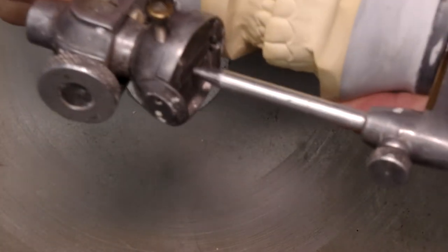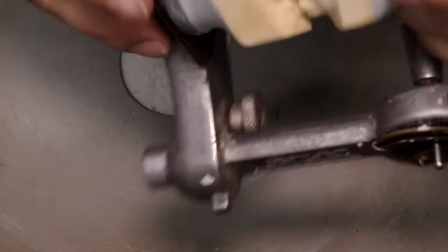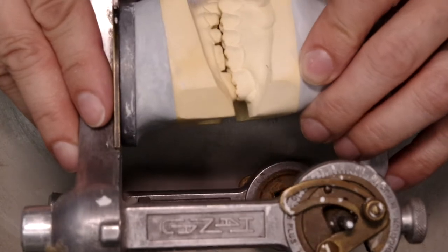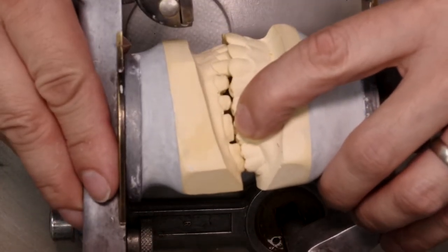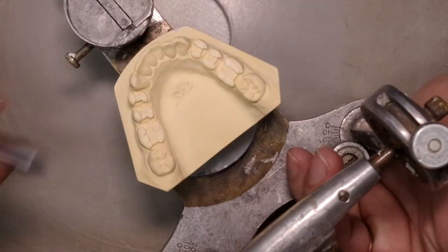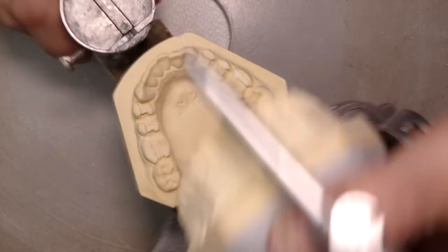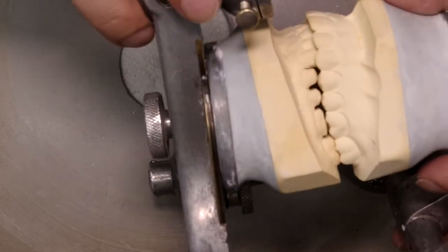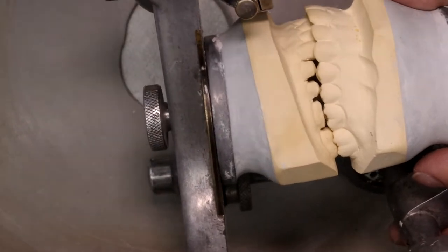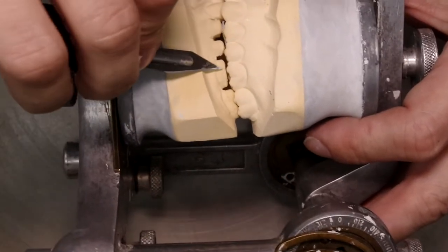So now, if we look at the models, we should have plenty of space on both sides. Here we could take off a little bit more. Always check. A little bit more right over there.